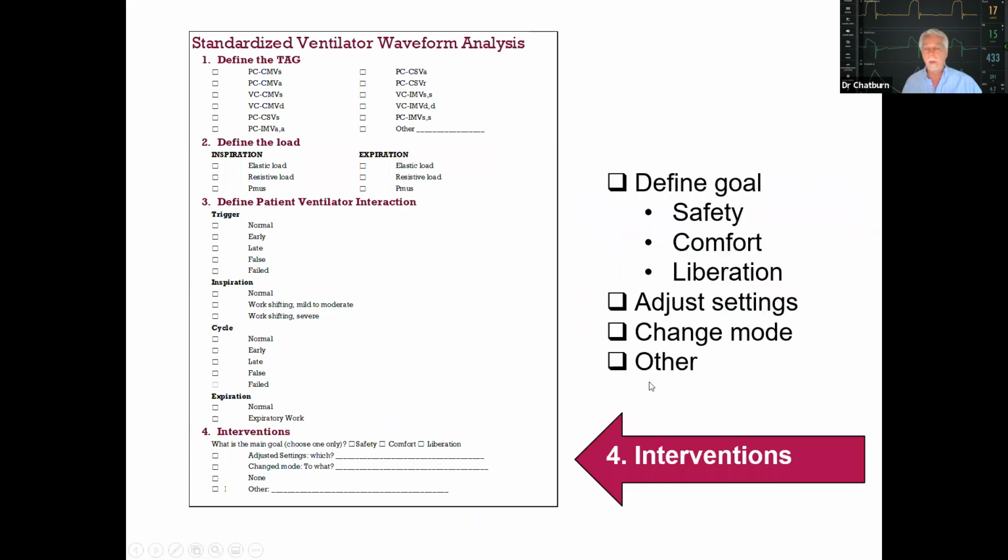And finally, all of this leads up to, okay, if we see a problem here in terms of load or patient-ventilator interaction, and it's not optimal, what are you going to do about it? Well, first of all, you have to define what's the goal of ventilation.